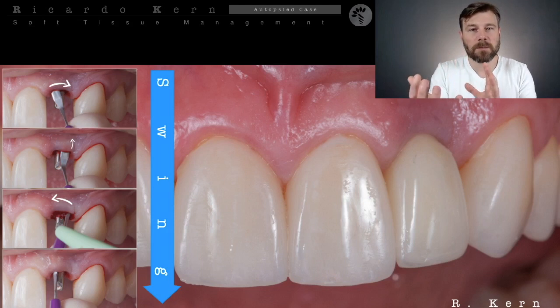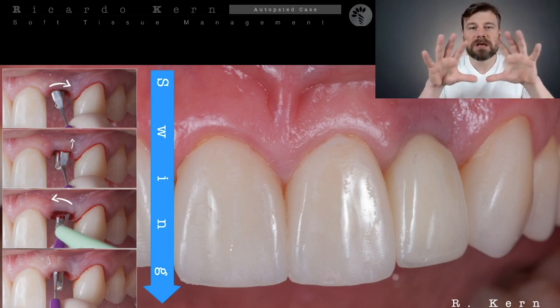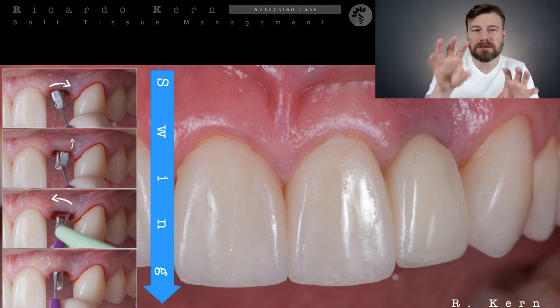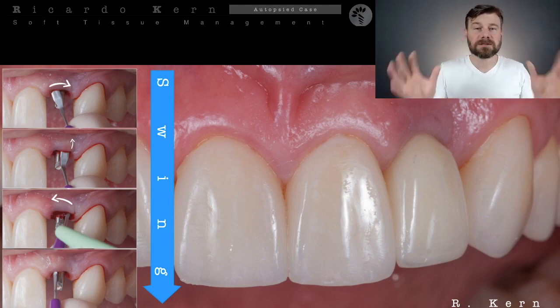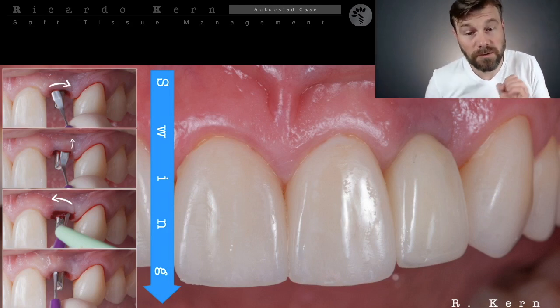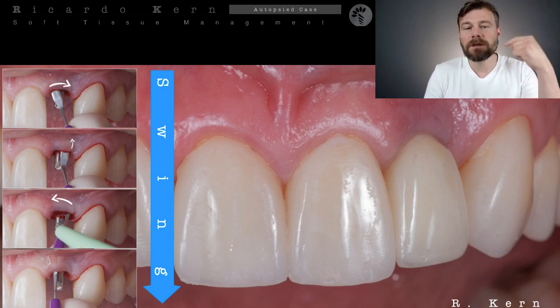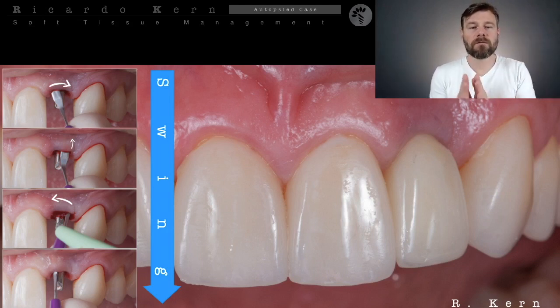And if you have some necrosis on the surface, you're going to show the connective tissue under that. If your connective tissue survives, you're going to have some small difference in the esthetic appearance between the tissue that you graft and the surroundings, and we do not want that. So it's not everything in favor of a full thickness flap.